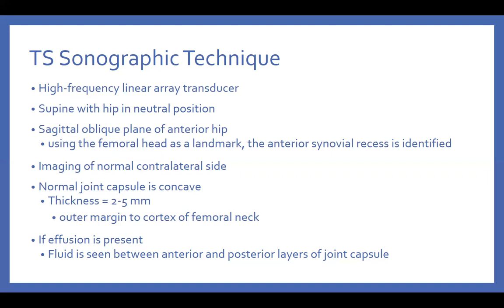In addition, what's important when we perform this examination is to compare the abnormal or symptomatic side with the normal contralateral side. That gives you an idea of what's going on. Always use this as a general rule: compare it to the normal side, the other side, the contralateral side.